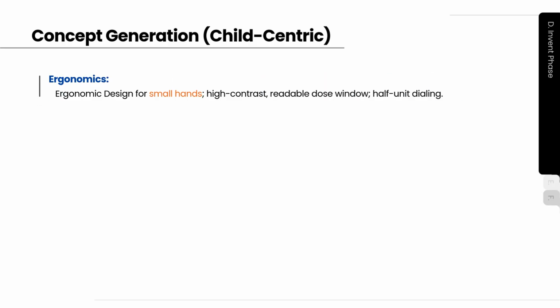By grounding concept generation in regulated user need definitions, the design remains child-centric while staying aligned with medical device development requirements. These design directions are directly derived from the validated user needs identified earlier. Ergonomic decisions focus on small hands and clear dose visibility.